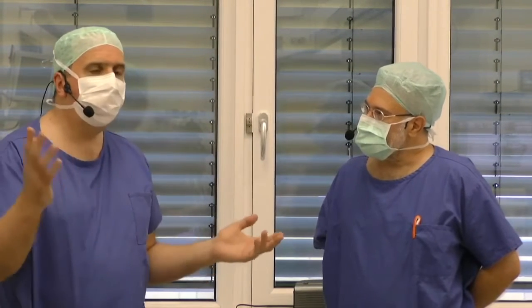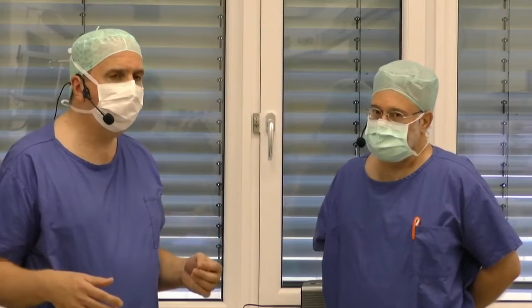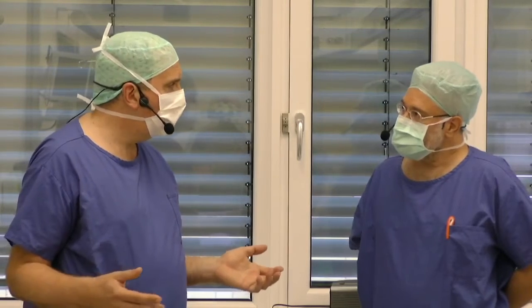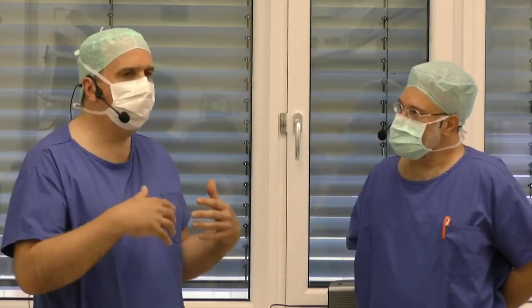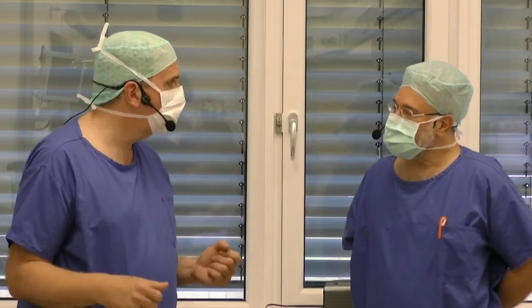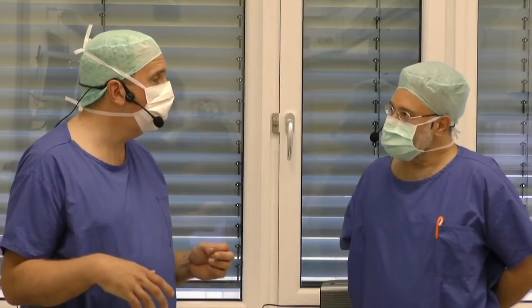Absolutely. We had a patient in this morning also doing a Liberty system. The patient was +8 with a corneal astigmatism of -4, and this was an absolute wow effect. The patient can walk outside this clinic without glasses and can see. Yeah, it's a certain wow effect. Absolutely.